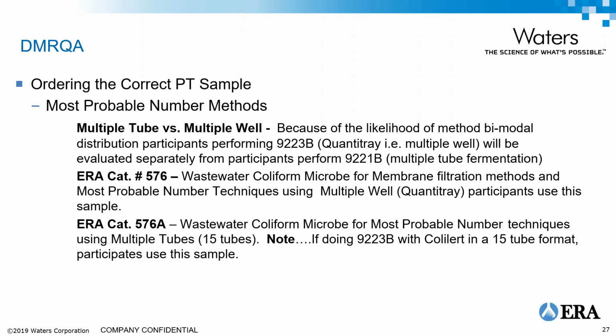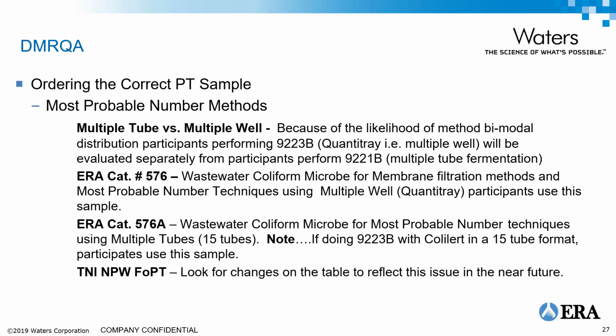In the very near future, TNI will be updating the non-potable water FoPT table to actually split out the analytes into 9 as opposed to the current 6 to deal with this very issue. But right now, just make sure you order the right part number.